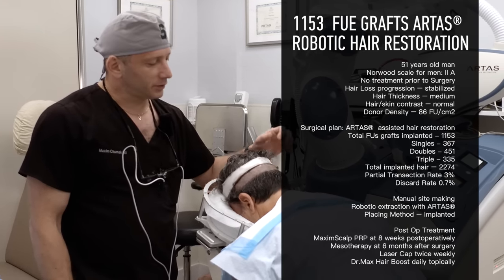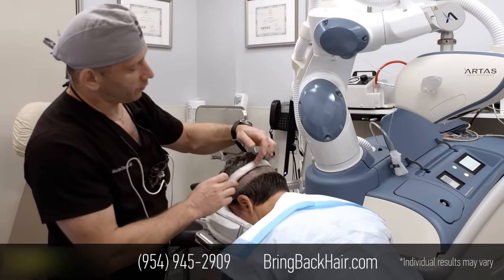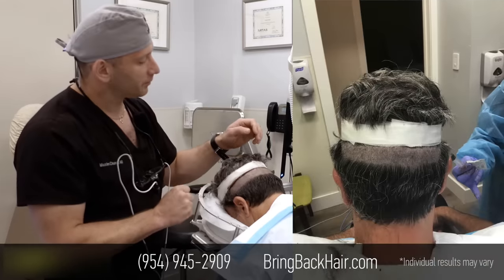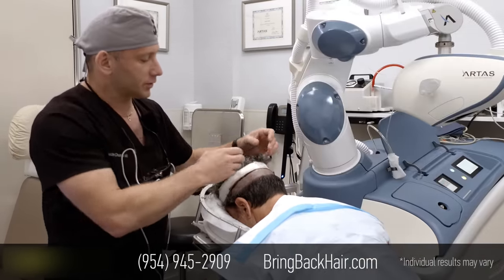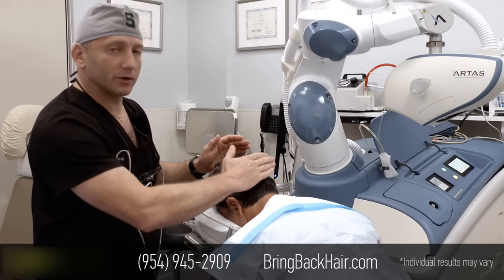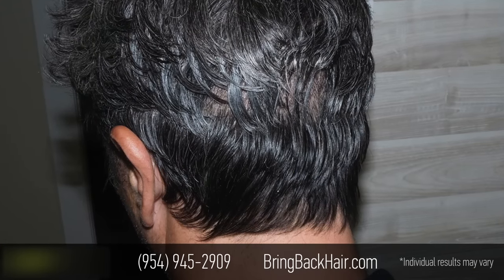What we do differently today is we utilize what we call a shaveless technique. What we did before is we created a strip of trimmed hair to 1.2 millimeters. This hair was trimmed in a way so that the hair above it, once we're done, is going to cover the harvesting area. So after the procedure, it's not going to be noticeable that our patient had anything done.